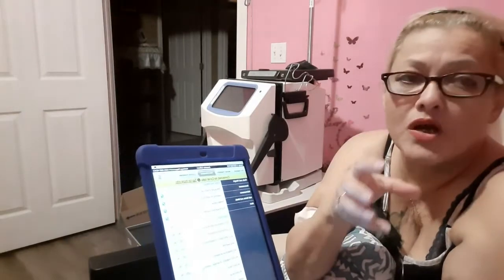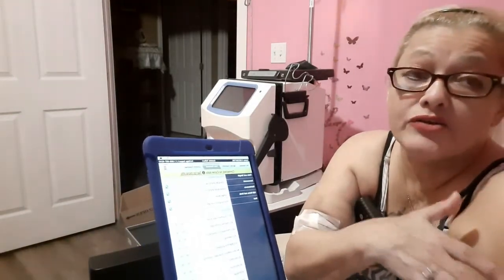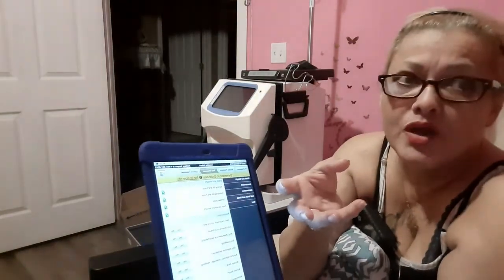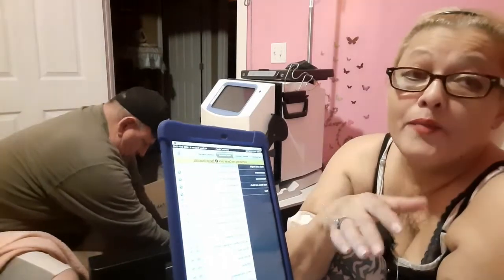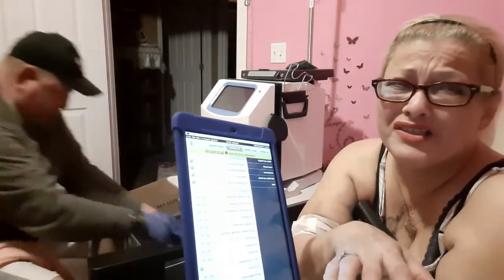prescription, the 6 days a week, and dialyzing at home with the slow pace, if you do it 6 days, you don't have to take so much off at once, whereas when you go to the center, you only go 3 days, so they try to take off as much as possible in those 3 days. You build fluid daily when you don't dialyze anyway. But if you miss a day, that's fluid buildup, waste buildup, and that makes you feel yucky and lousy, you know?